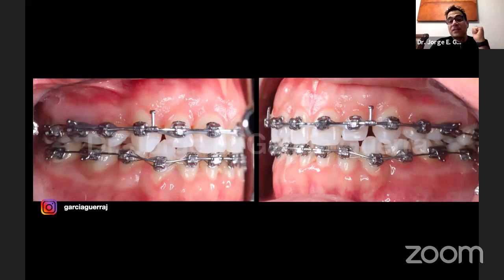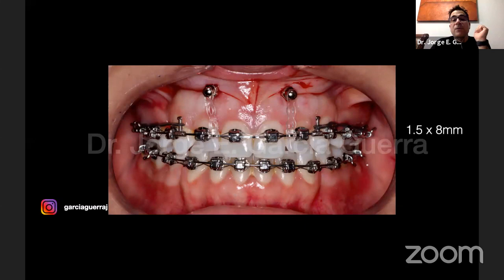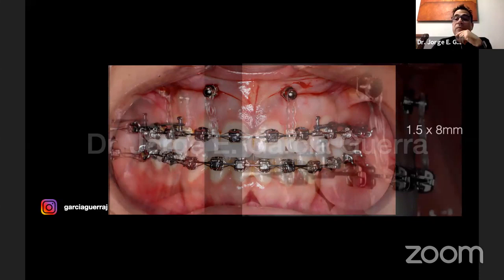Like in this case, we put some TADs, 1.5 by 8 millimeters, in the anterior segment. We put them between the central and the lateral incisors. What I wanted here was a little bit of intrusion so we can close spaces. Now you can see that we're using very little force and we have it with a metal ligature on the four incisors so they don't open the space. And what we're going to do here is correct the anterior position. So you can see that I use this very often.